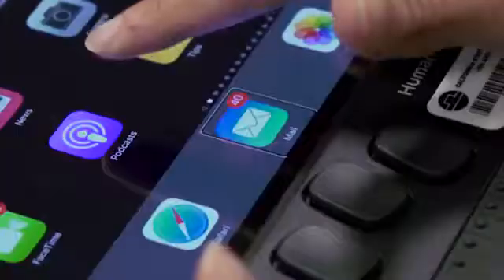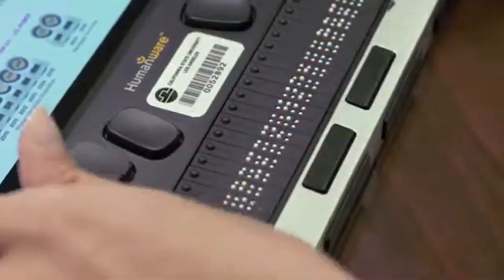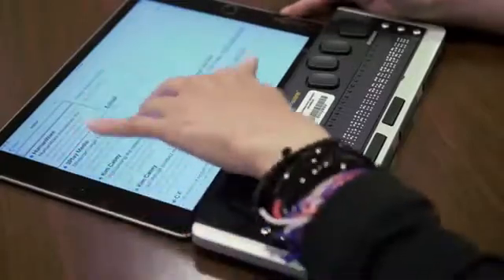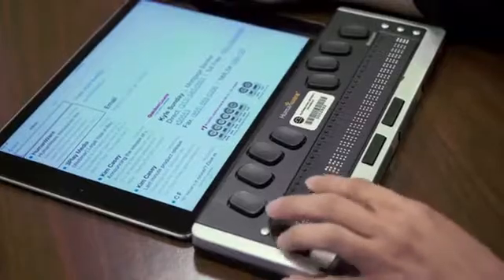So you go to the mail icon. The main advantage of having a Braille refreshable display is you don't have to have the sound turned on. You can mute the sound and still use the iPad with the Braille refreshable display. So I'm going to compose an email.